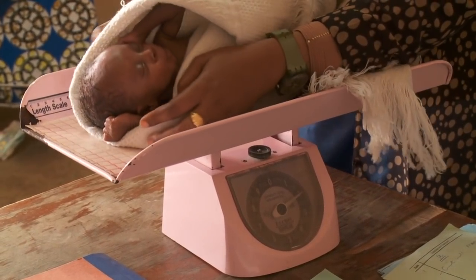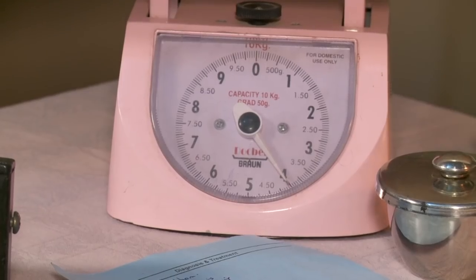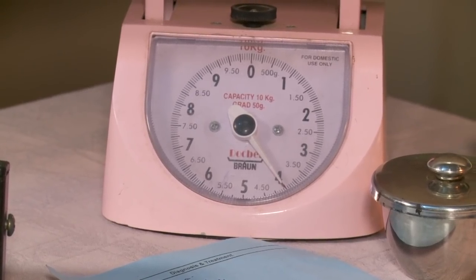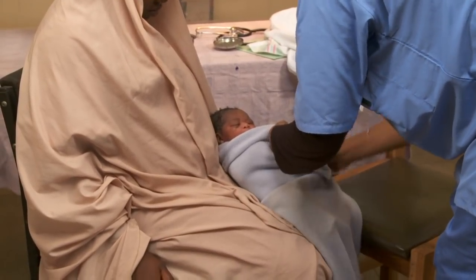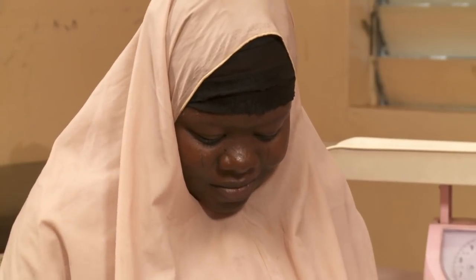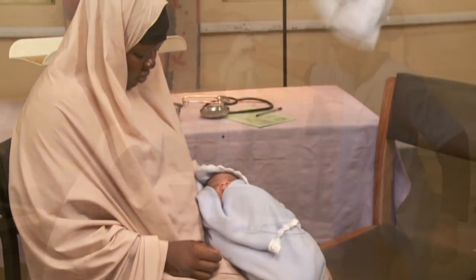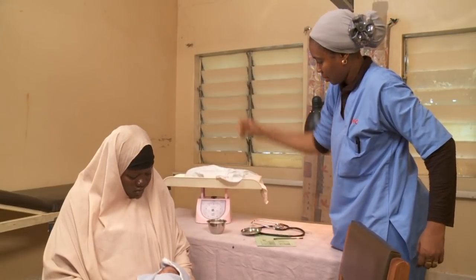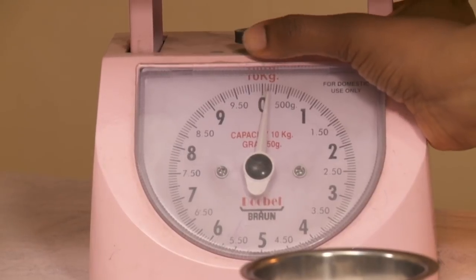Here's how to take the baby's weight. An accurate weight is important for calculating drug doses and to monitor the baby's growth, but it's also important to keep the baby warm while you weigh him. First, place the baby's cloth on the scale pan and set the scale to zero to include the weight of the blanket you will wrap him in.